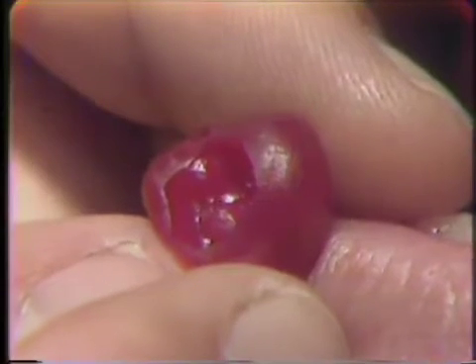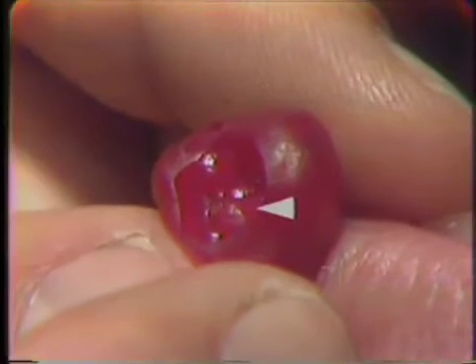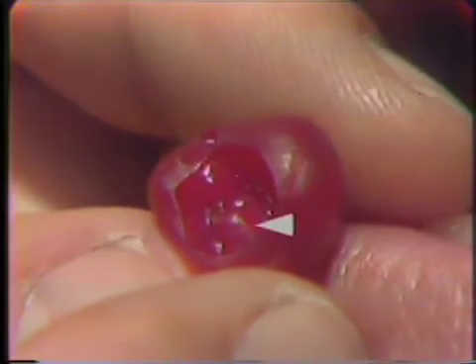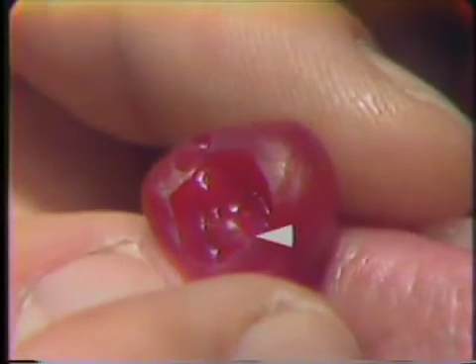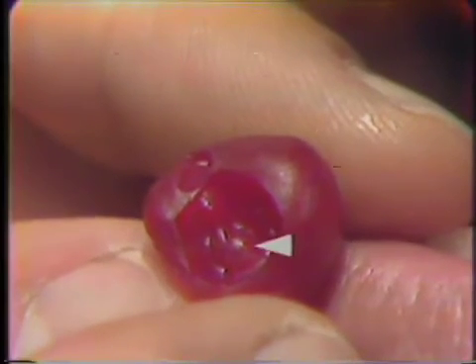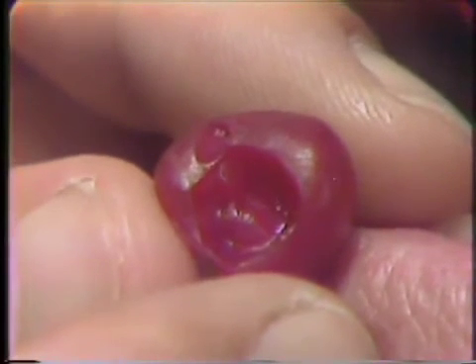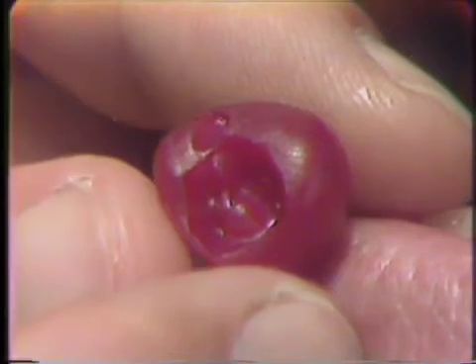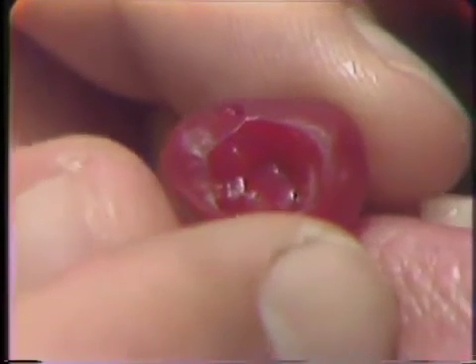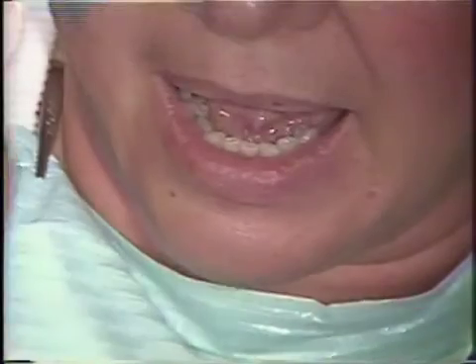As we're inspecting the wax, what we're looking for is the little dimple that we have created in the tooth. If a carbide burr is not available, this round dimple can be created with a round diamond instrument or a round gemstone. It's not necessary to use a carbide burr specifically. One thing we would have to do in addition to creating this dimple is to round the marginal ridge area over so that it is not sharp. So this rest, although it has a good start, it is not completed, and we will have to complete this one and go on and create rests for the indirect retainers.